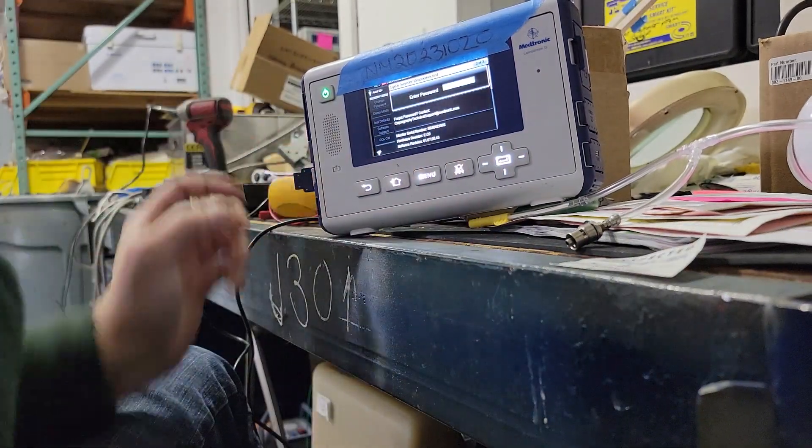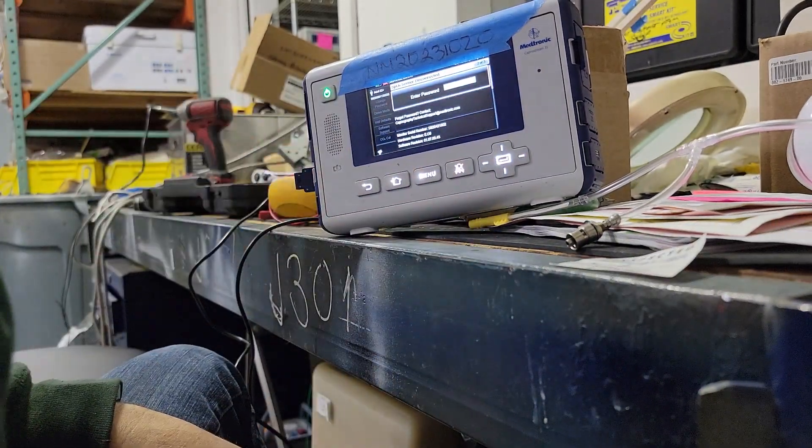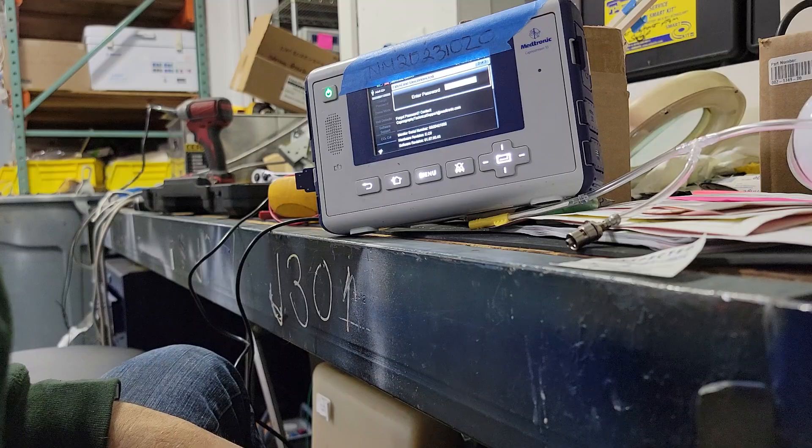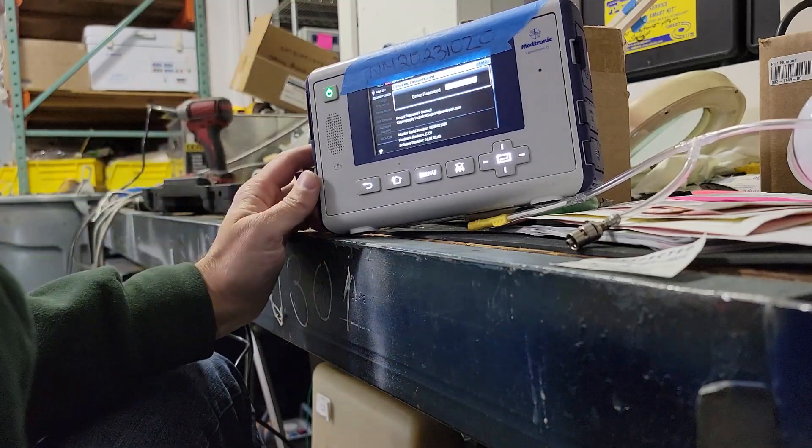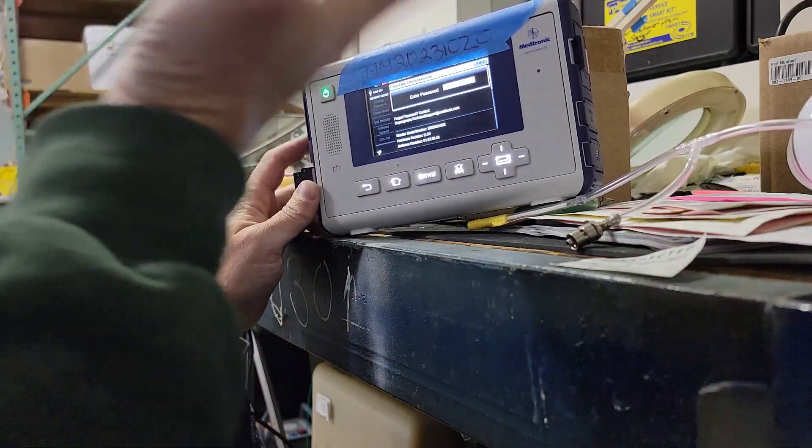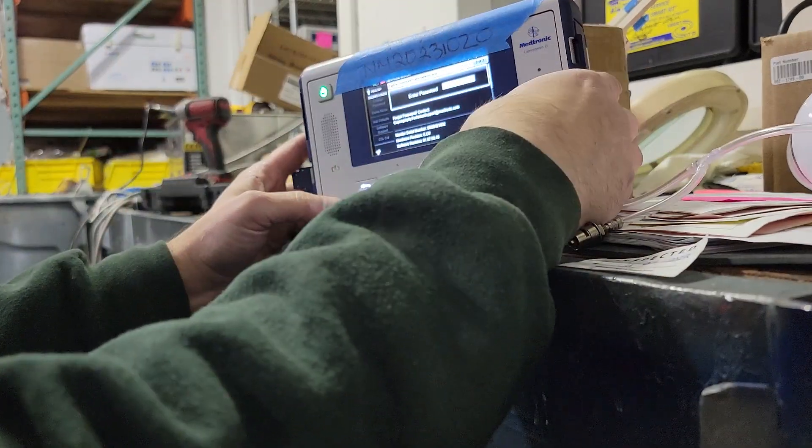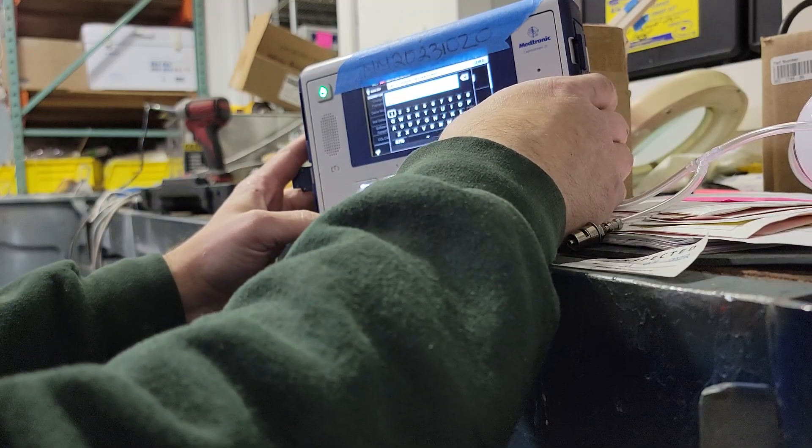Now the password is S-E-R-V. Some units, for whatever reason, the password is service1. This one happens to be service1 instead of just SERV.